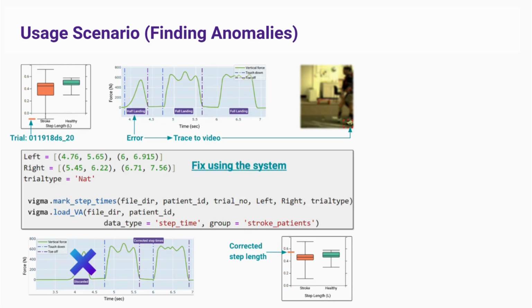There are 2 more usage scenarios performed with experts and reported in the manuscript. Our system received very positive feedback from the practitioners across different labs and clinics.